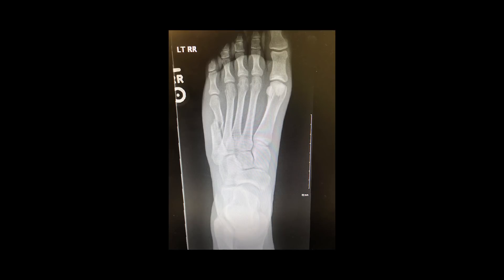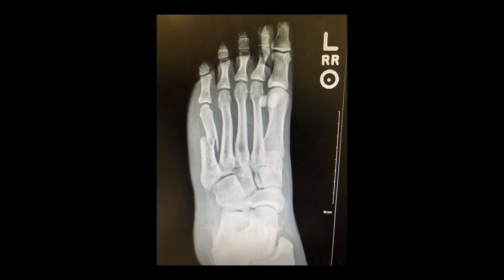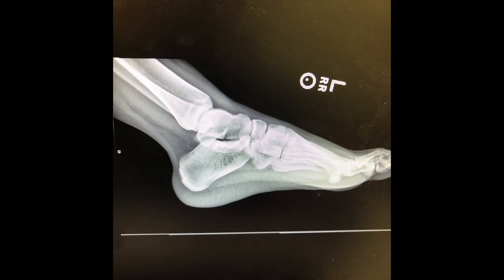Here is a case of a young girl who had a pretty bad fifth metatarsal fracture. Let's take a look at the AP first. This is an example case in which I used the hitch stitch for fixation. And here is the medial oblique view. Classically when I see these fifth metatarsal fractures they always seem to be worse intraoperatively than these pre-op x-rays show. And here is the lateral view. Now we're going to see a couple CT scans to show the severity and the amount of comminution in this fifth metatarsal fracture.